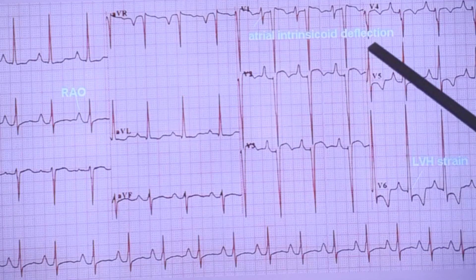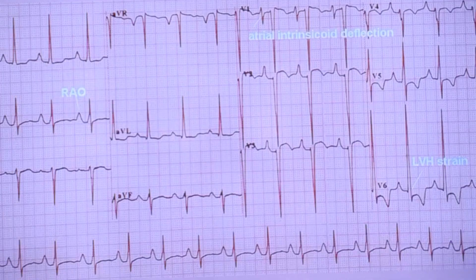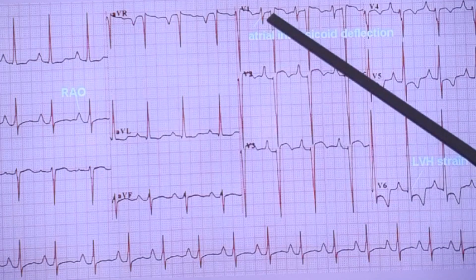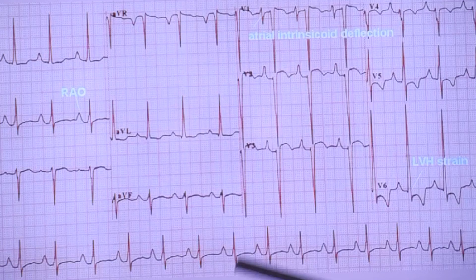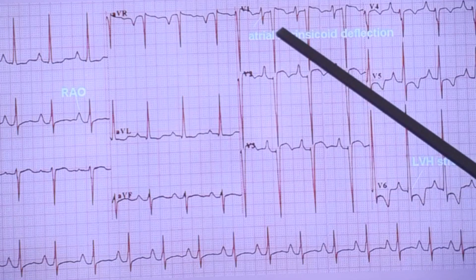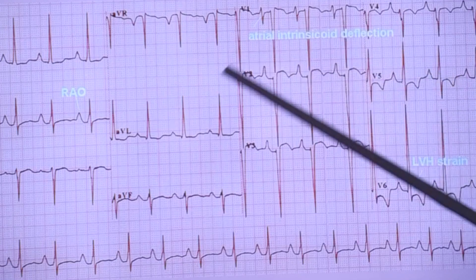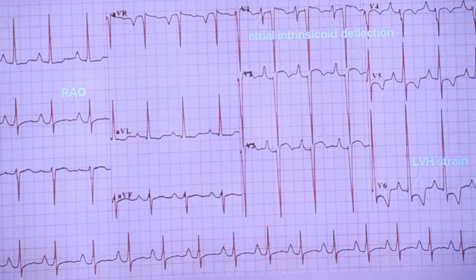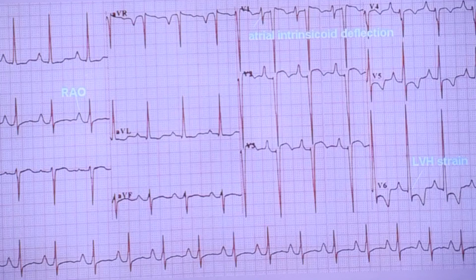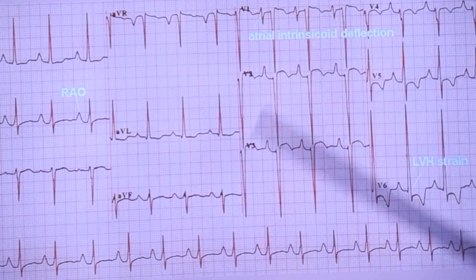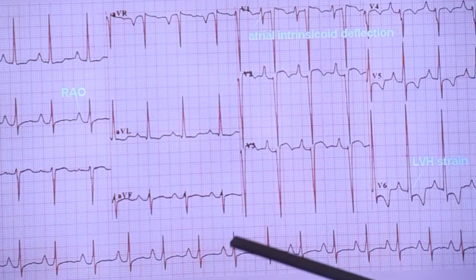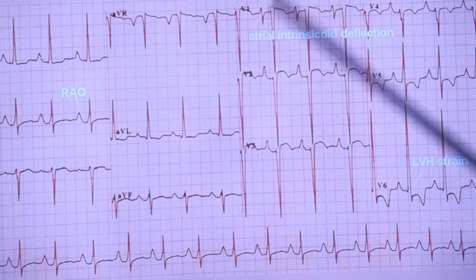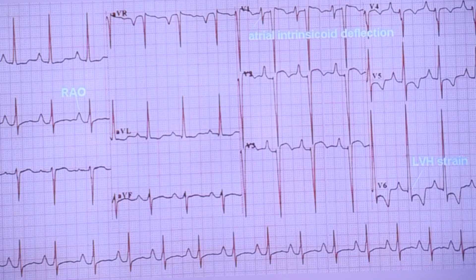This is another manifestation of right atrial overload and not left atrial overload — the negative portion of the P wave is due to right atrial overload, with a prominent atrial intrinsic deflection. Sometimes you see such patterns in atrial septal defects also, without Luttenbacher syndrome. In Luttenbacher syndrome, the left atrium could be enlarged where mitral stenosis is associated. Even without that, this type of pattern will occur in atrial septal defect — fairly common.